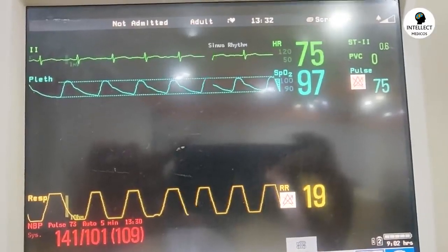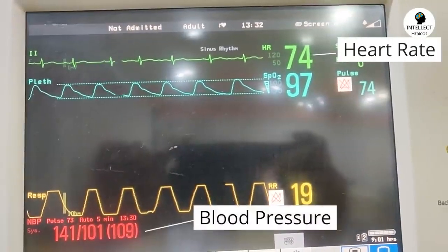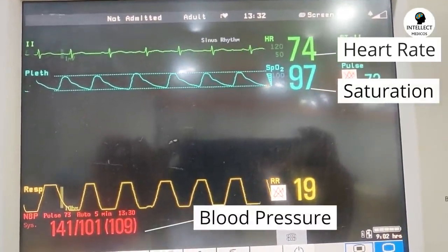So now after giving all these medications, one needs to have an eye on the monitor also. You need to see the heart rate of the patient, the blood pressure of the patient, and the saturation. It's not like you just intubate and don't see the vitals. That is a very, very important task, right? So you need to ask your nursing staff or your attendant or your colleague to have a look at the monitor while you are performing this procedure.